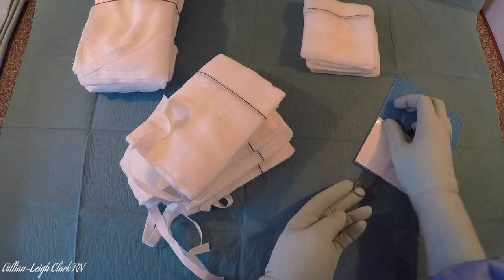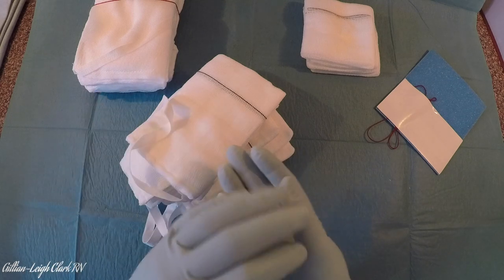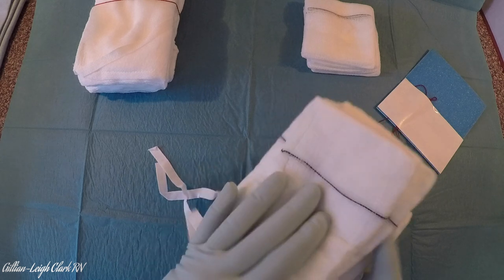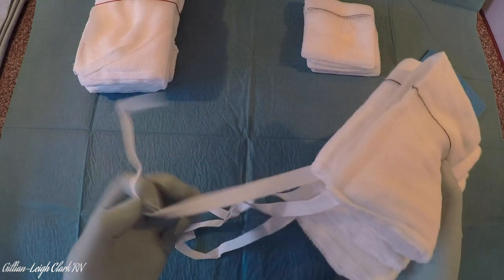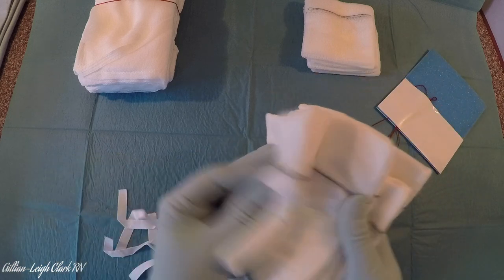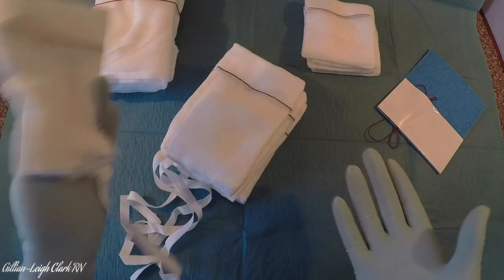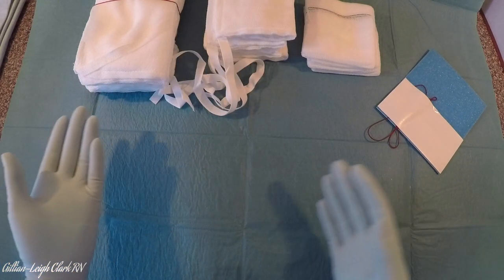If at any point your floor nurse wasn't happy with the count, or you felt as though you'd had a small stutter when counting them, you would start again — and they would be perfectly within their rights to ask you to do so. You'd just pick them up; you've pulled all your ties, everybody's happy with them: 1, 2, 3, 4, 5. And off they go into wherever you're going to store them.